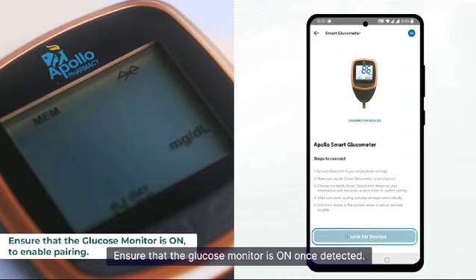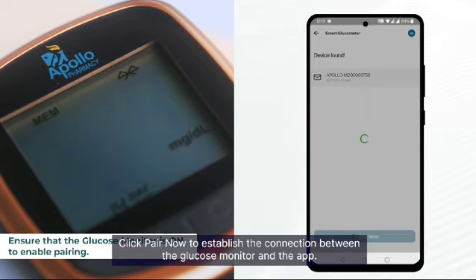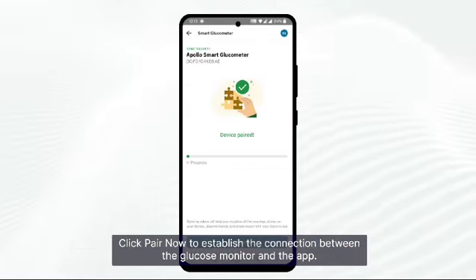Ensure that the glucose monitor is on. Once detected, click 'Pair Now' to establish the connection between the glucose monitor and the app.